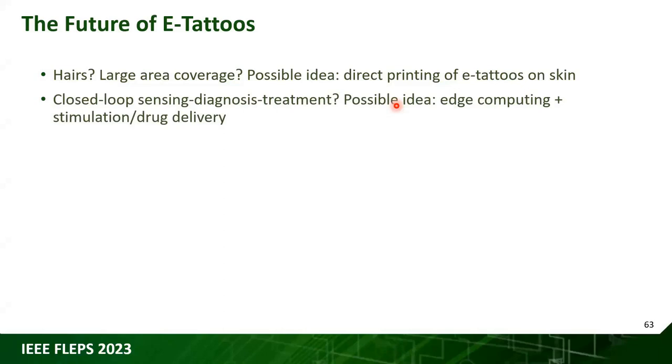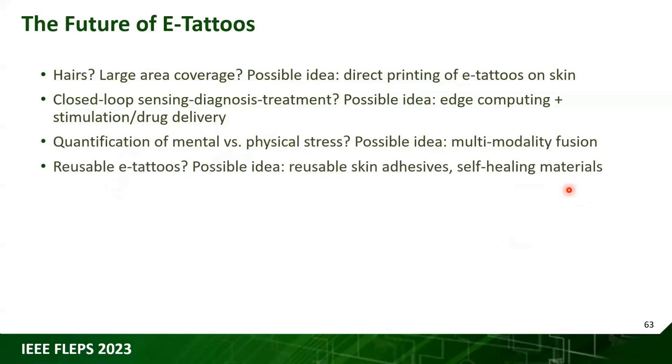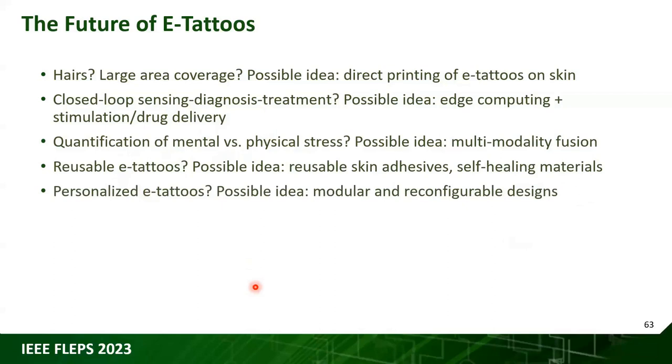And how about closed loop sensing diagnosis treatment, right? In this case, you can use the cloud if you have internet connection, but if you don't, we need edge computing plus stimulation and drug delivery management. Wei is actually already actively doing a lot of those edge computing work, right? Quantification of mental versus physical stress, right? We need multimodality fusion. Reusable e-tattoos, currently those ultra thin ones are not reusable, but we want to still reuse the electronics and the battery, hopefully.